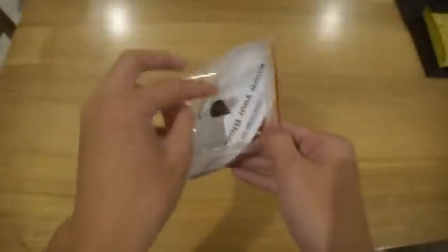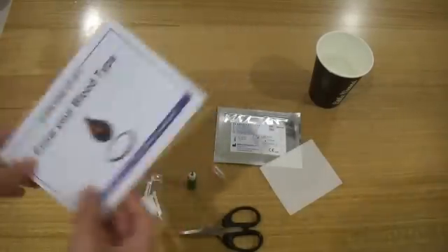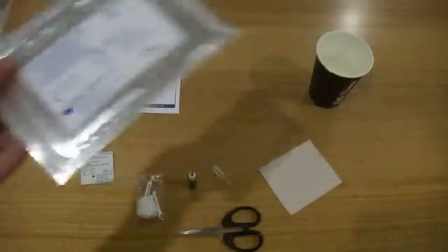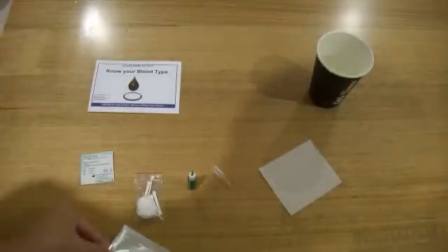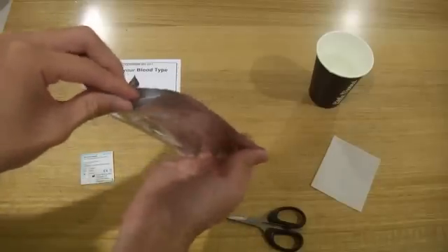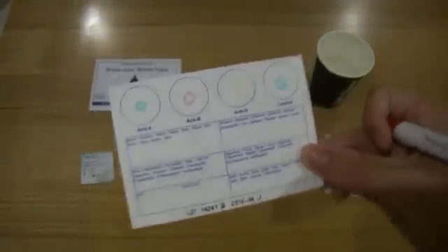So let's open it. I just unpacked it, and here are the instructions — I already read them. First, we get the Eldon card out, so I'm going to cut it. As you can see, it contains four different circles, and I'm just going to write my name on it.